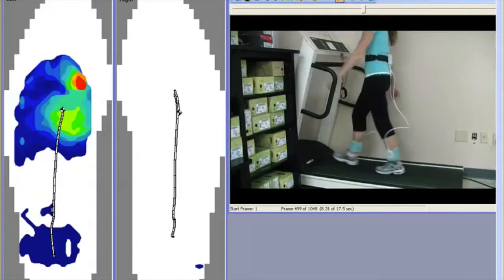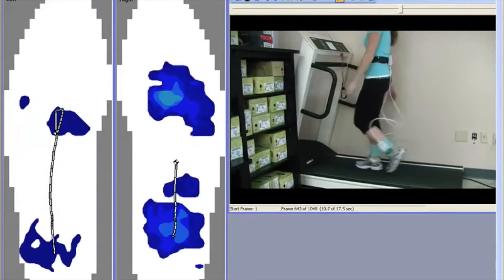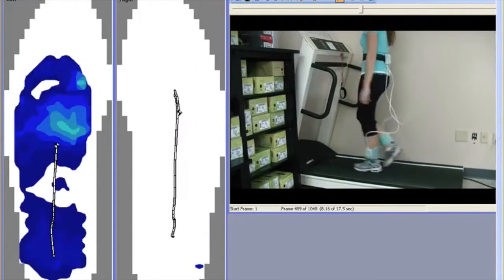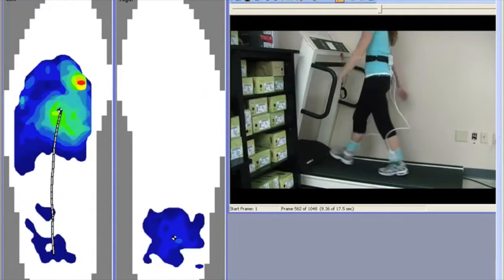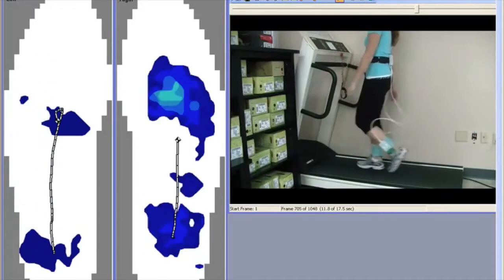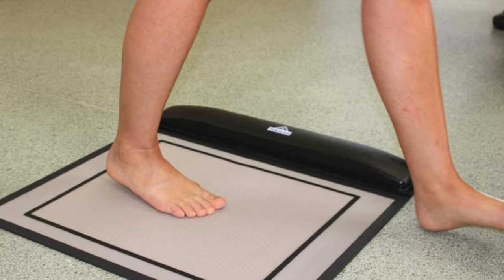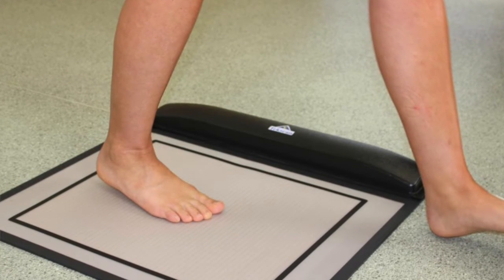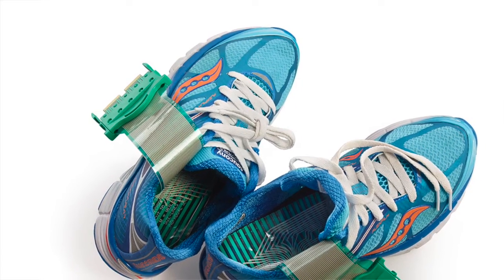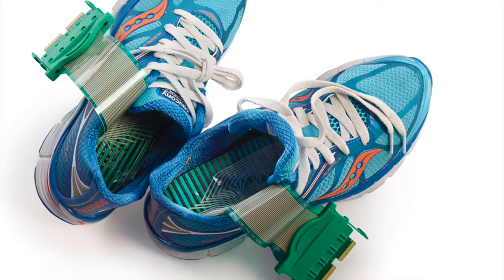Now, the next piece of gadgetry worthy of discussion is the in-shoe plantar pressure measuring system. You may have heard of the F-scan and PEDAR insole systems, which are used to collect and measure plantar pressure loads between the foot and the shoe. Other variations of these devices include the MAT-scan and eMed systems, which are pressure mats used to record barefoot pressure distributions in static and dynamic conditions. However, it's the pressure insoles which have the most compelling application to clinical gait analysis.